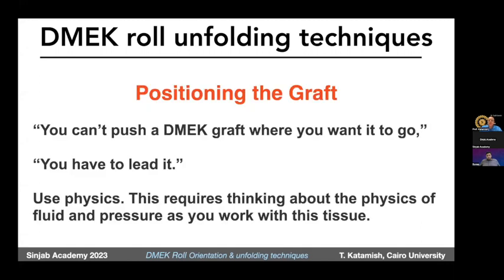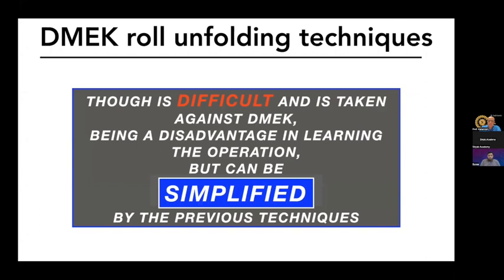Positioning the graft. You can't push a DMEK graft where you want it to go. You have to lead it. You have to use physics. This requires thinking about the physics of fluid and pressure as you work with this tissue.